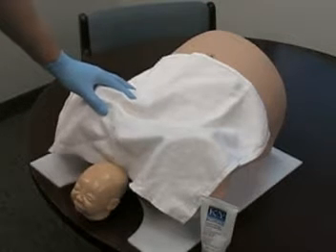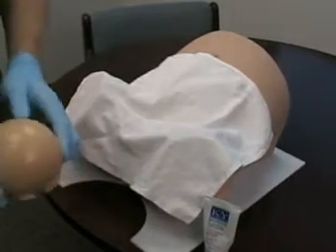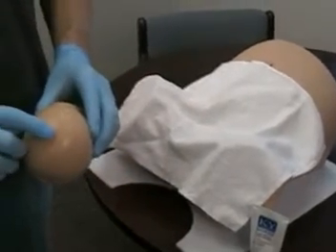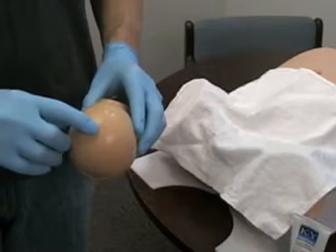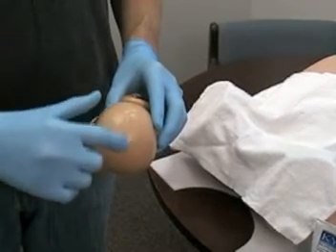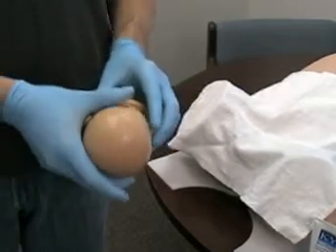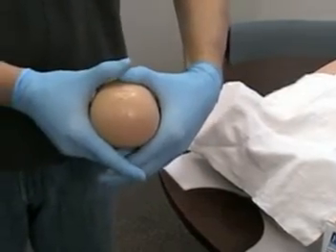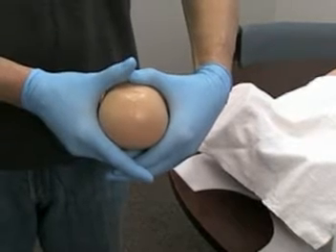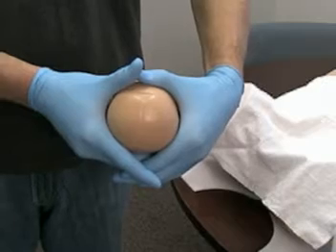The key to successful vacuum delivery is placing the cup over the flexion point. The flexion point is defined as 3 centimeters forward of the posterior fontanelle on the sagittal suture. This location directs the smallest diameter of the fetal head to present to mom's pelvis. Thus, the least amount of force is required to conduct the delivery.